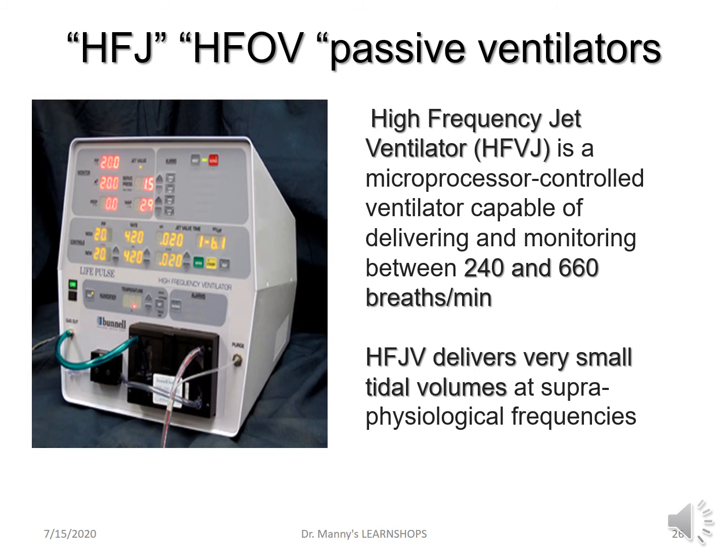Here we have an example of high frequency jet or high frequency oscillatory ventilation. These are passive ventilators. These ventilators are controlled by a microprocessor, and they're capable of delivering and monitoring between 240 to 660 breaths per minute and more so.